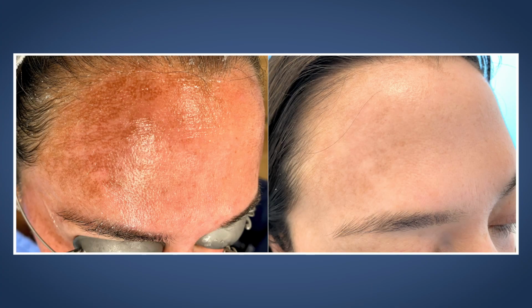What I did though with her is, she came along right when I got the BBL HERO, and I tried it with the small square handpiece on her forehead. So much lower energy, much less energy per pulse, but I was able to do multiple passes right over the pigmentation. Really? And then I did Moxie right away afterwards at a level 2, just like you said, at the 10 millijoules.